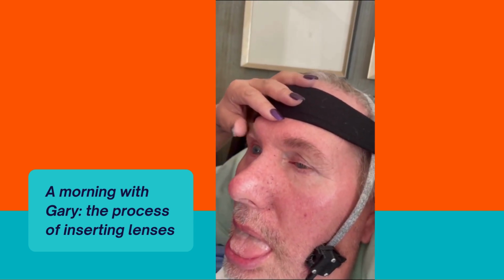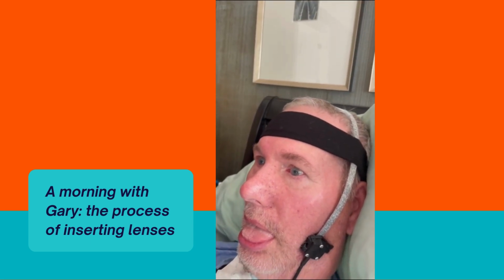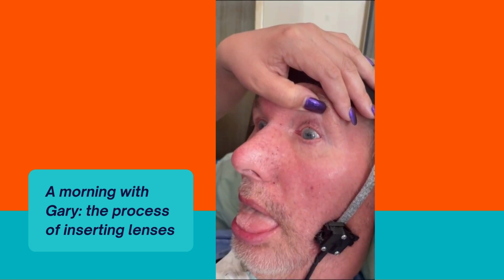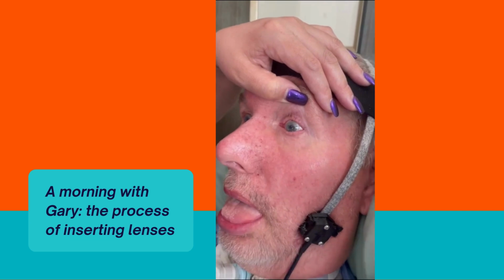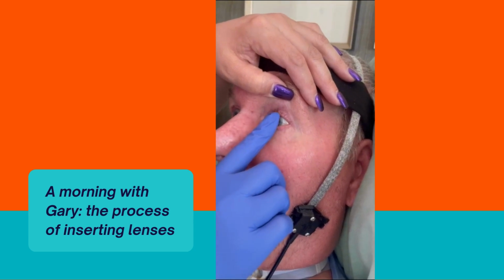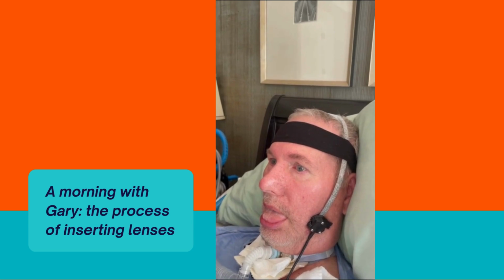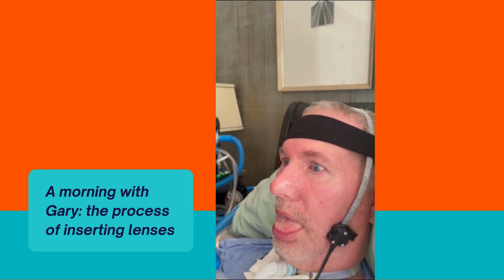You're a good swiper. I'm a light tapper. Can you show the light tap? The light tap would be 1, 2, 3, each one hitting at a different angle of the contact: one in the front, one in the middle, one on the end, and then you wipe it off on the cloth because you don't want to put the debris back in his eye. I do the lightest little tap, tap, tap, a little toward the top, a little toward the bottom, a little in the middle, because you want to cover the whole contact.